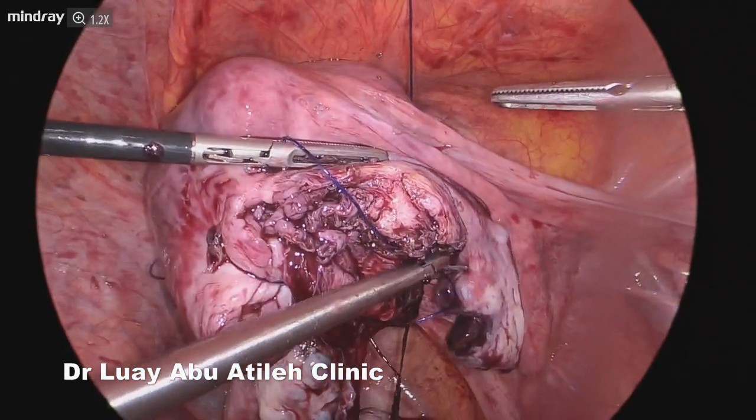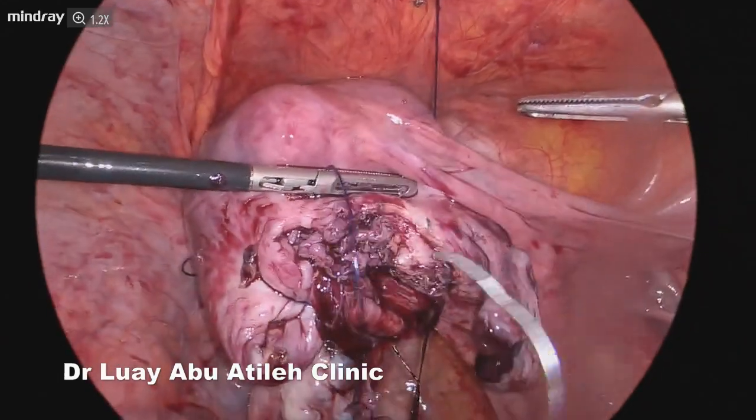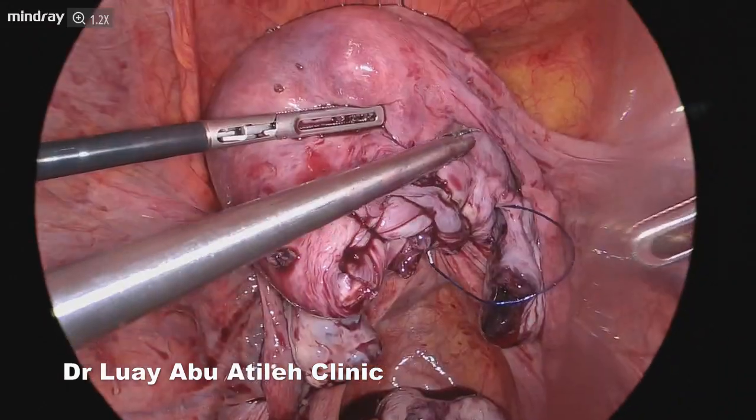As you see — eight centimeters, six centimeters, intramural and subserosal uterine fibroids — removed from the posterior uterine wall with very minimal blood loss.